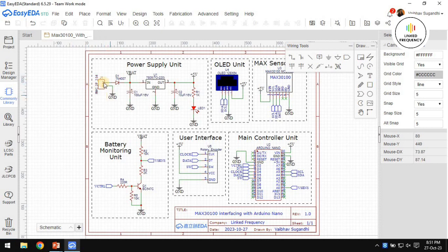By mistake, if we connect it in reverse, of course it is not possible. Why? Because we are using an RMC connector for that matter only. However, if you use a normal Berg header or a normal soldering and all, there is a possibility that you connect the positive to the negative, negative to the positive. In our case, this diode will protect in such a situation.